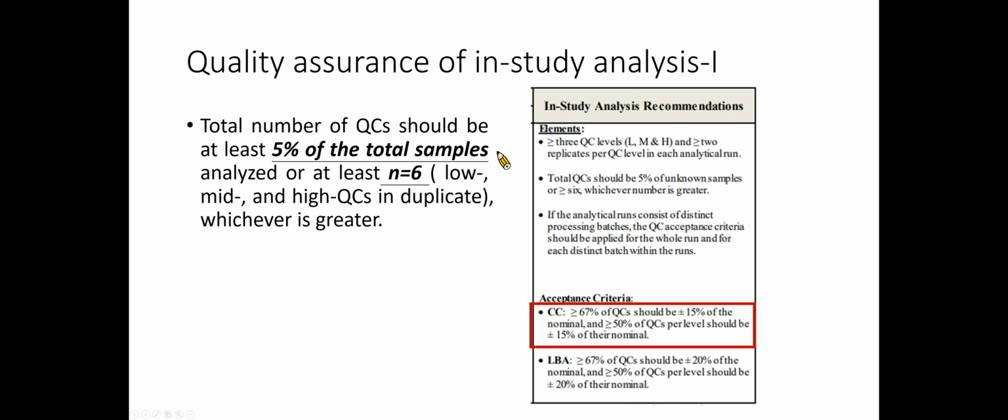If the additional QC concentrations are not bracketed by QCs validated before the study, the accuracy and precision of the additional QCs should be demonstrated before continuing with the analysis. If the partial validation is acceptable, samples that have already been analyzed do not require reanalysis.